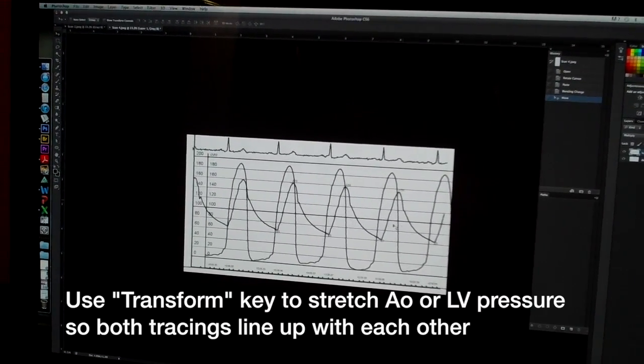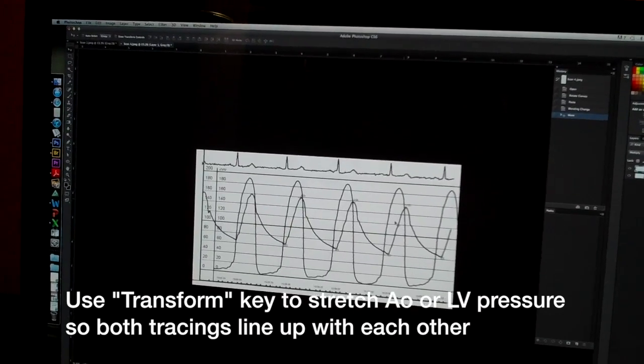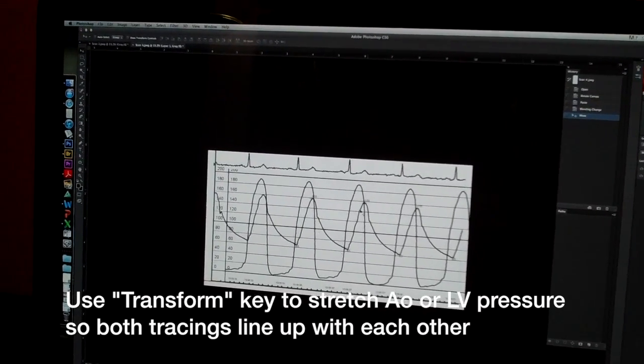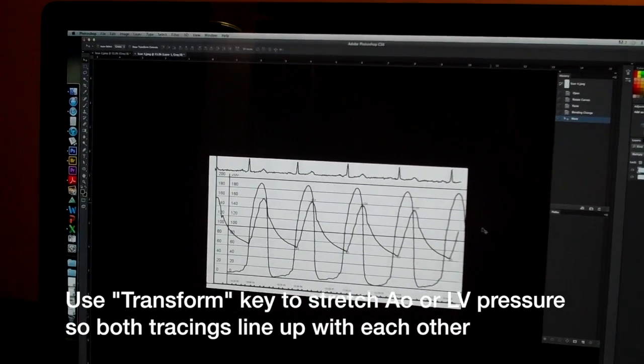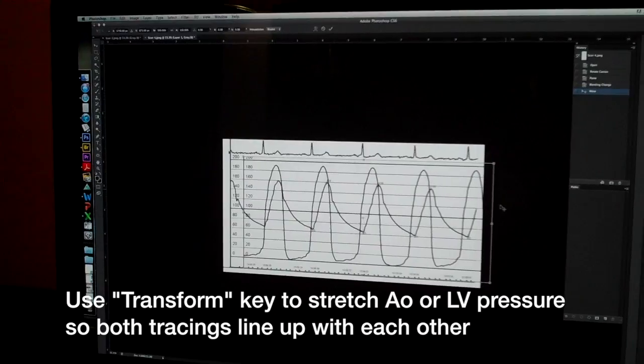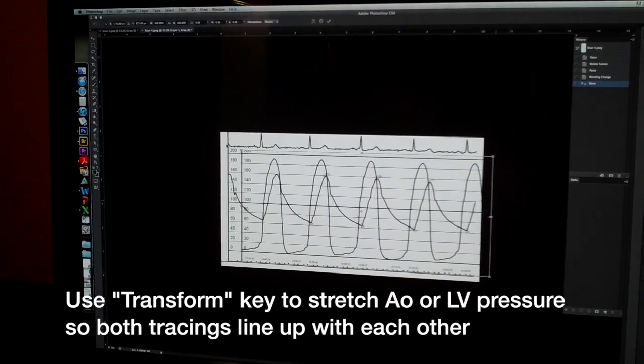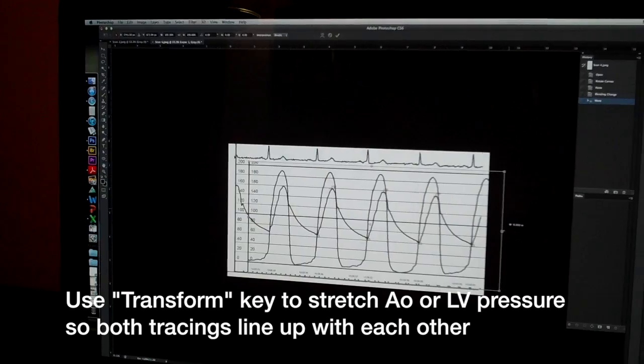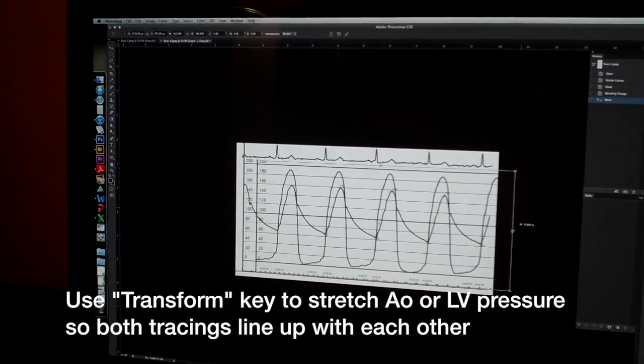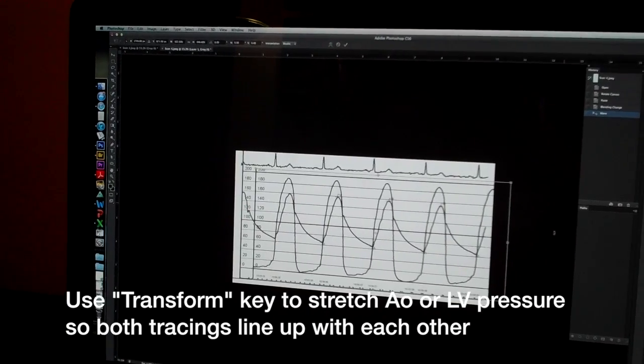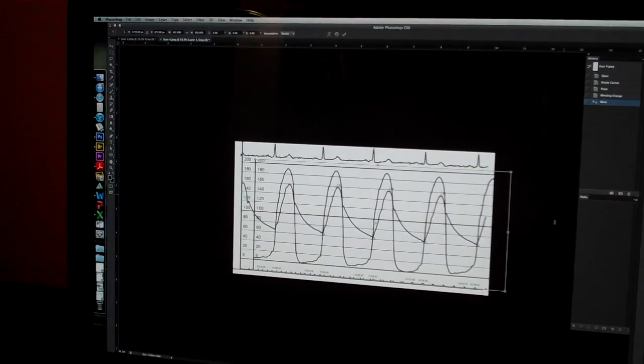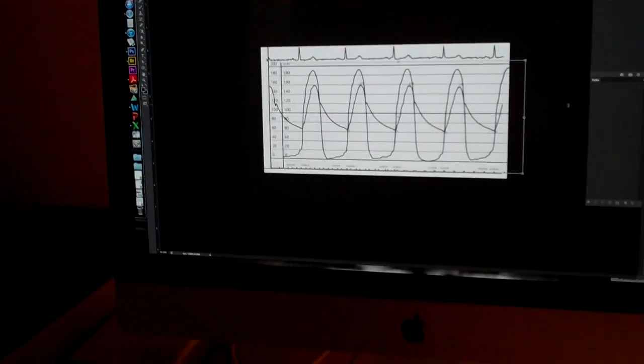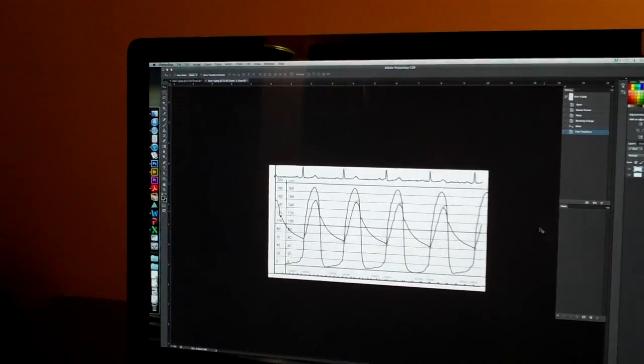So I'm lining up on the notch of the aortic pressure here with the first ventricular pressure. And you notice that the aortic rate here is a little bit slower than the LV rate. So what I'm going to do is I'm going to stretch the LV tracing out a little bit. So I'm going to hit command T, which is transform. And I'm going to pull out the LV pressure tracing just a hair to match the underlying aortic pressure. Once I get that done, I'm going to key return, which sets the transformation.